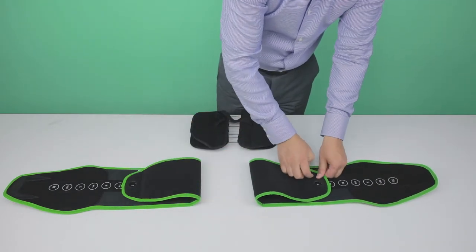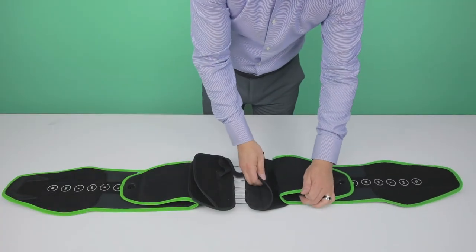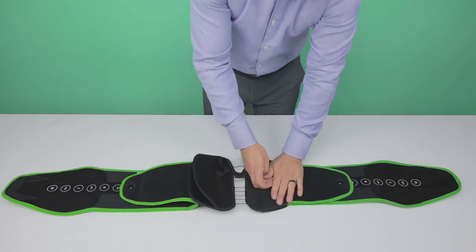Fold the end of the brace and press down firmly. Insert and center both soft panels into the center clamp and press down firmly.